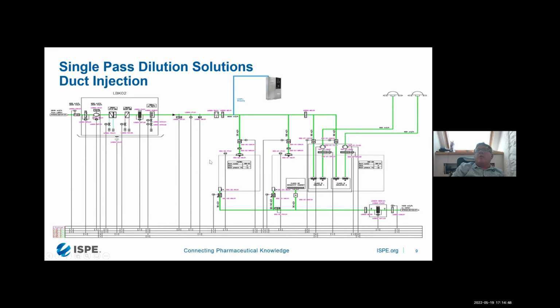You mean in terms of aeration, I believe? Yeah. Okay, perfect. So yes, aeration is part of the cycle development work. If people have to come back to the volume, we want to be below 1 ppm before we get the people back in.